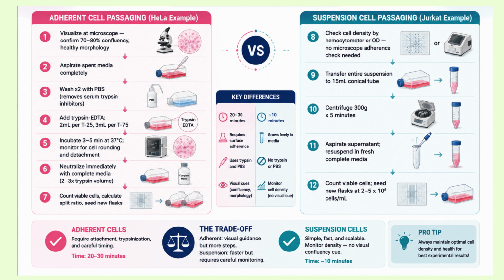No trypsin, no PBS wash, no waiting for detachment. The entire process takes 10 minutes versus 20 to 30 minutes for adherent cells. The trade-off: you must monitor cell density carefully because there is no visual confluency cue.